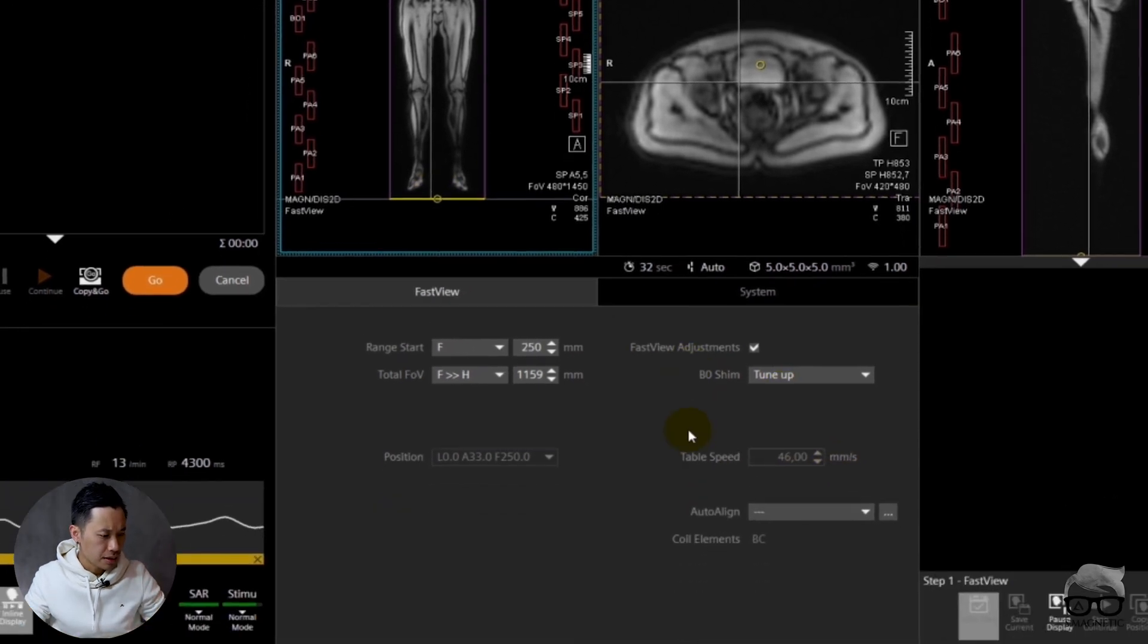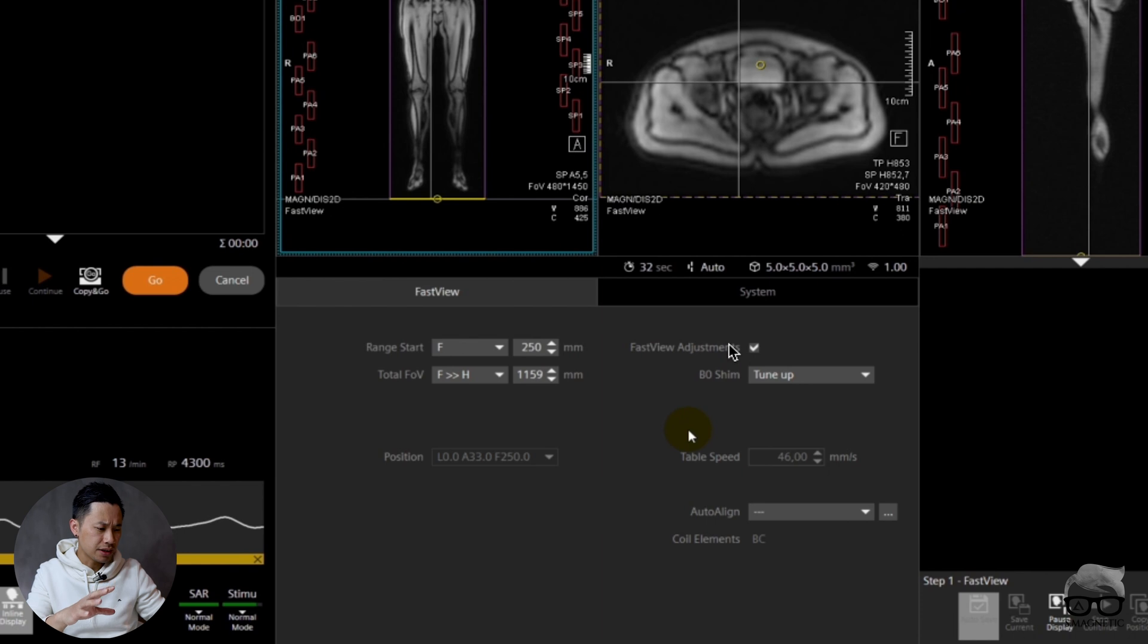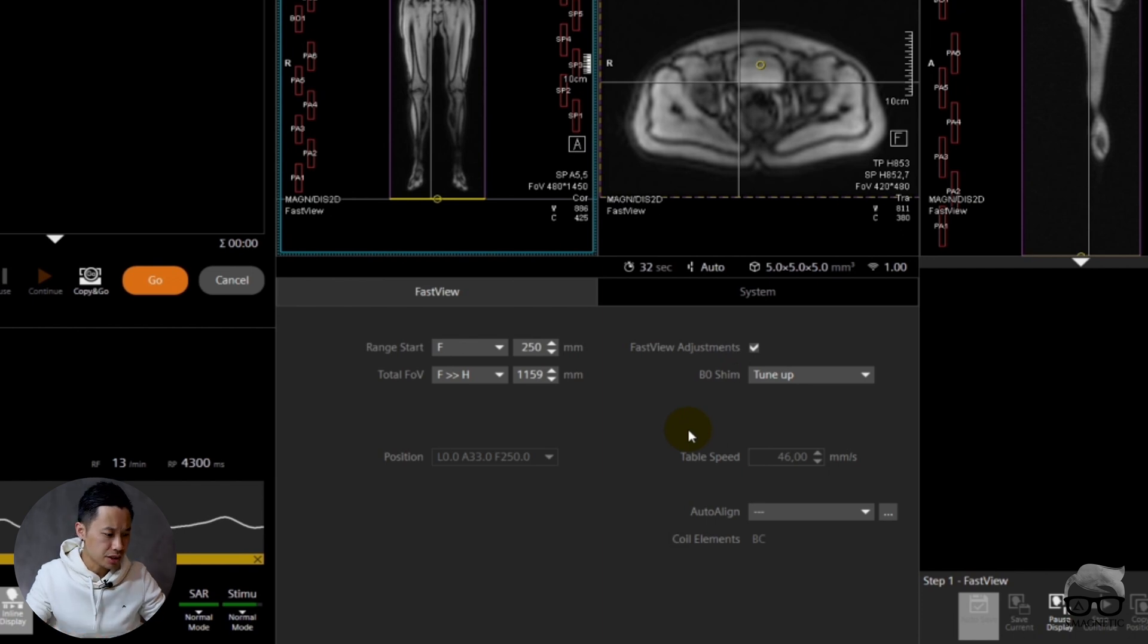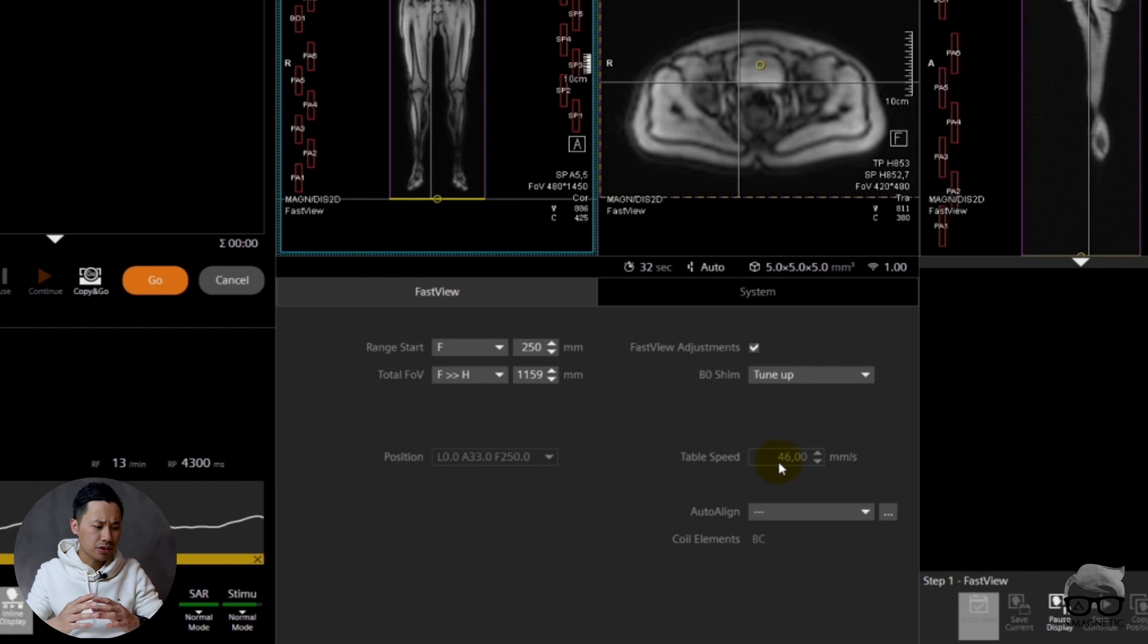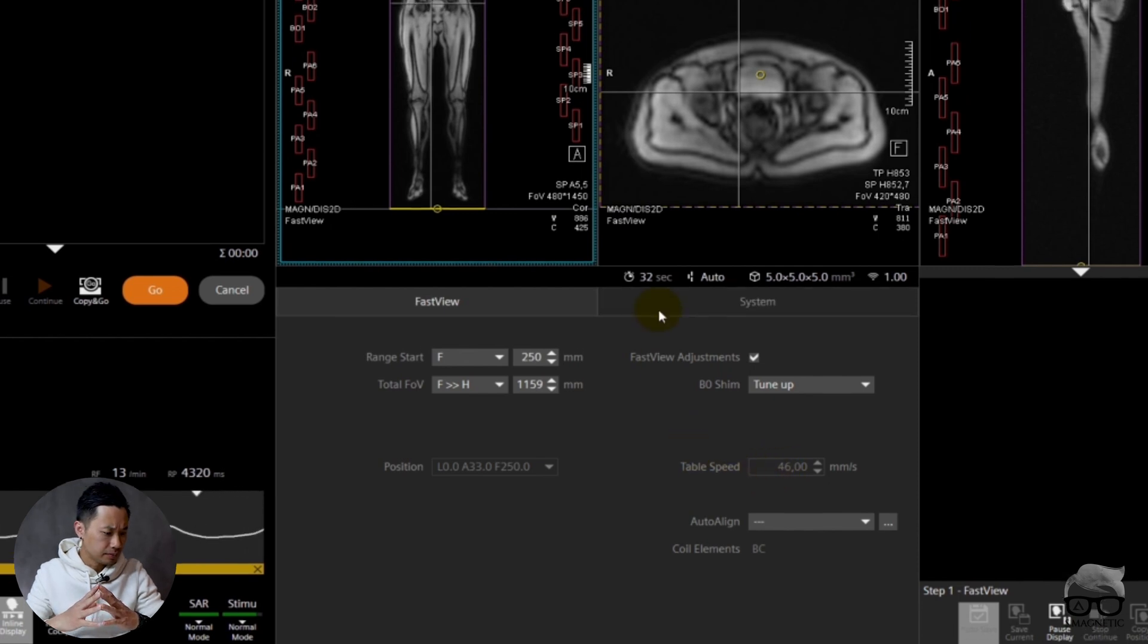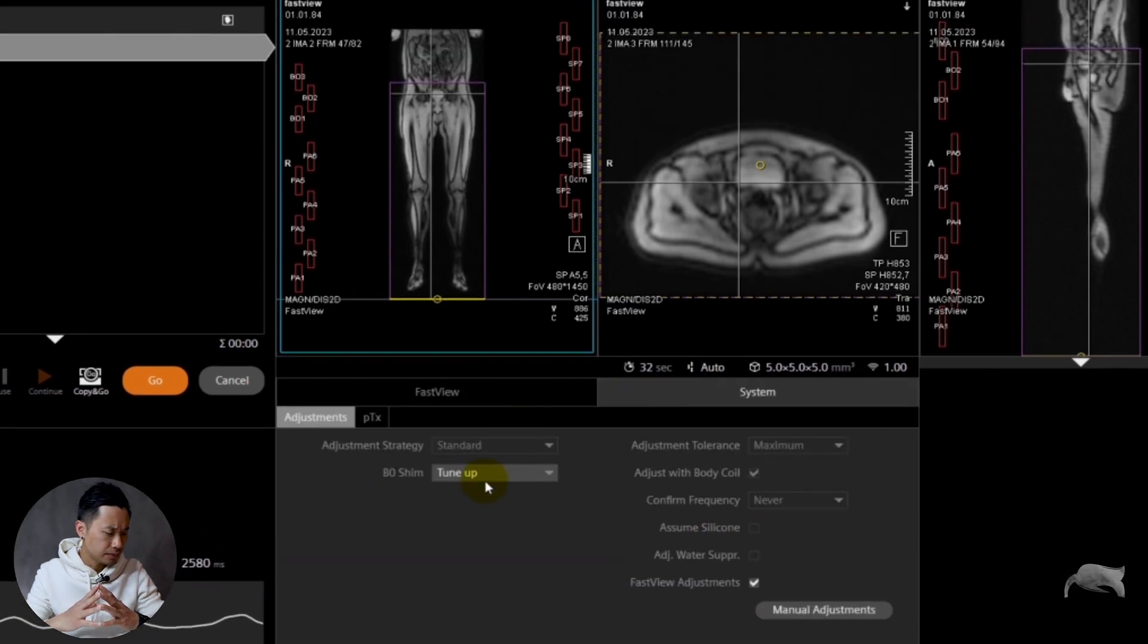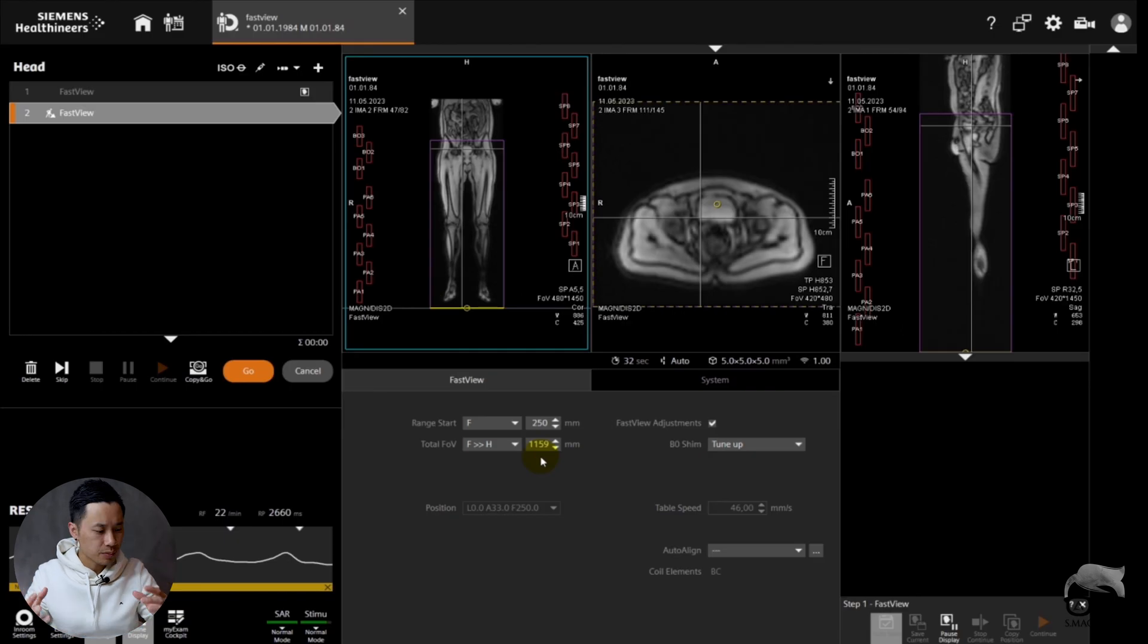You can see the sequence itself is very minimal with the parameters to adjust. It says the table speed here is 46 millimeters per second, and there's not that much you can adjust. Okay, let's move on and let's do another test.